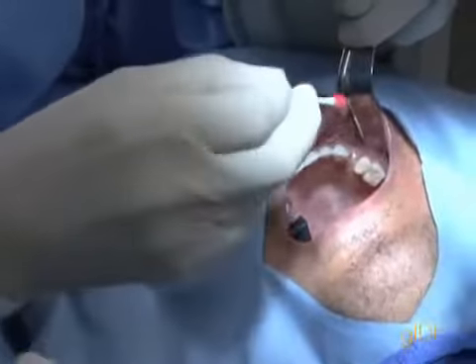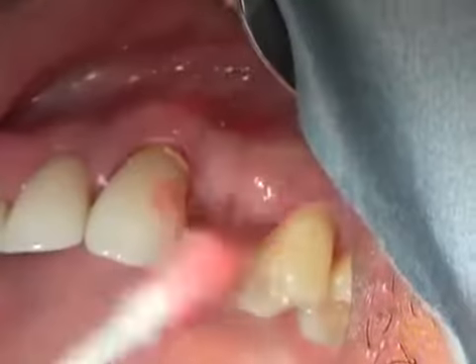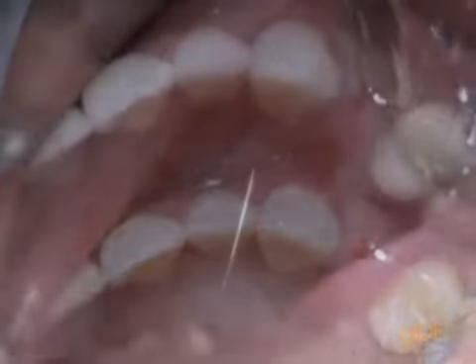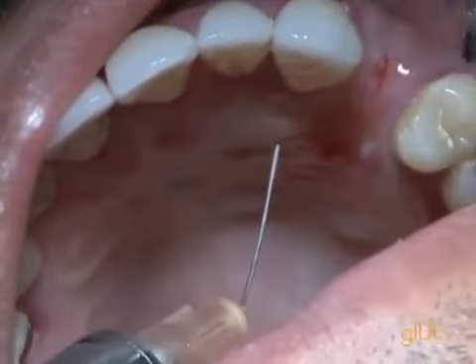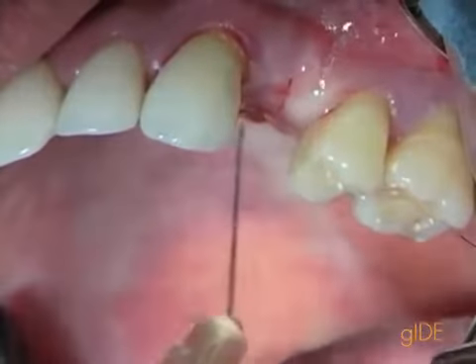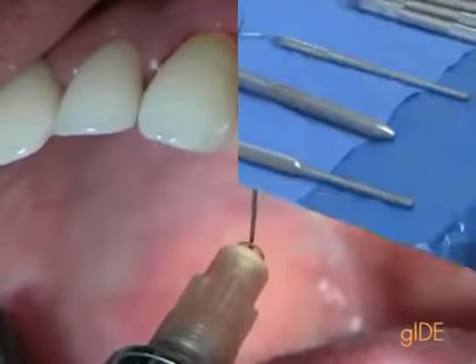Topical anesthetic is used for the surgical site, and local anesthetic can either be infiltration, as used here, or through block anesthetic. Here, local infiltration anesthetic is used in the palate, on the crestal and buccal.